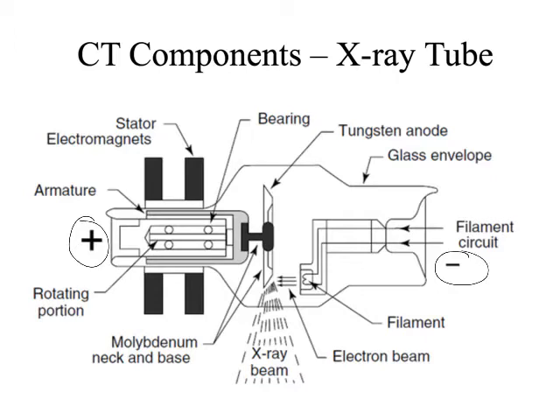The big thing that happens in terms of the production of the X-ray beam, and I think y'all are talking about this right now in physics, so I won't belabor it too much, but what is the primary way that X-rays are produced? So we said we're going to bombard this anode with electrons. We're going to hit those two rocks together, right? And it's going to crap out a bunch of X-rays, right? And we think that's awesome. We're monkeys and we think that's awesome.